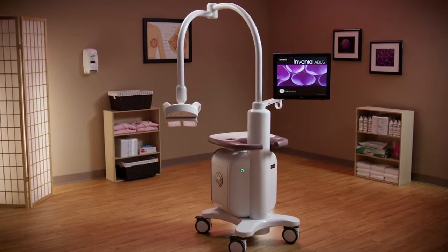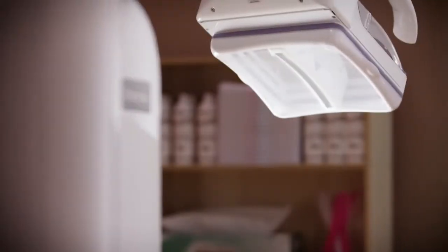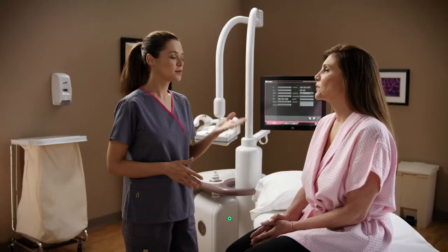Invenia ABUS 2.0 Automated Breast Ultrasound System uses 3D ultrasound technology to comfortably and quickly image women with dense breast tissue. Invenia ABUS has been proven to improve cancer detection when added to mammography.